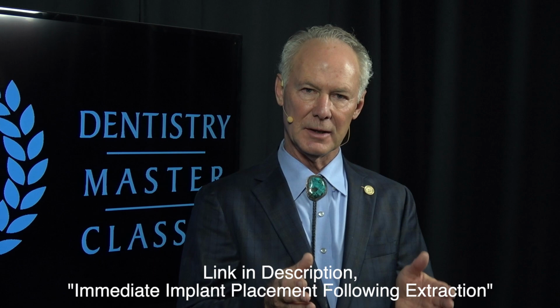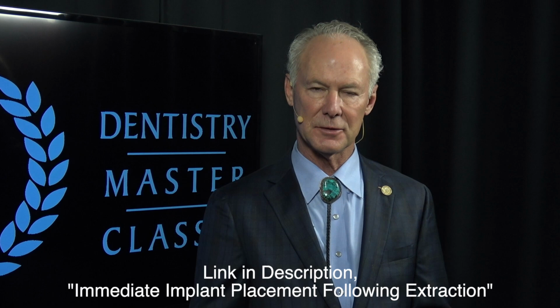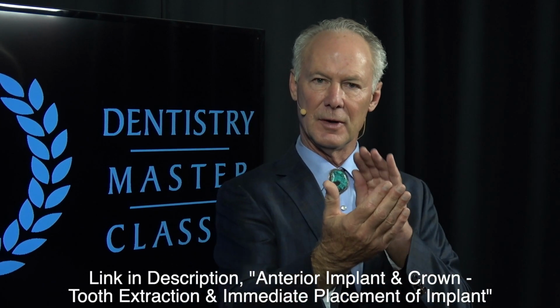Now, the way you normally place an implant, you extract the tooth. If it's a single rooted tooth, sometimes those implants are placed at the time of extraction. I often place the implant at the time of extraction if it's a single rooted tooth and we can extract the tooth straight out of the socket. And I usually do that with a system called the Easy Extract. It just takes it right out of the socket so you preserve the facial and the lingual or the palatal bone. Then you place the implant, you can graft a little bit around it.